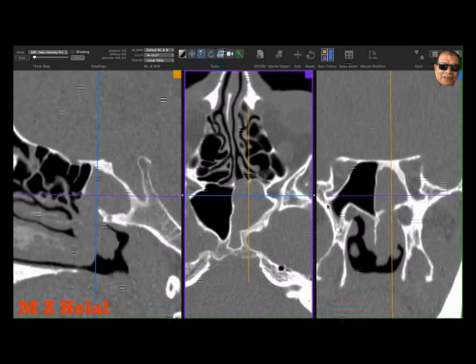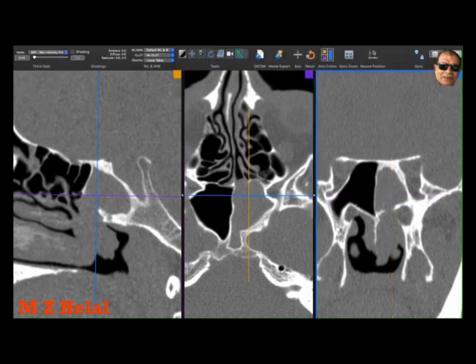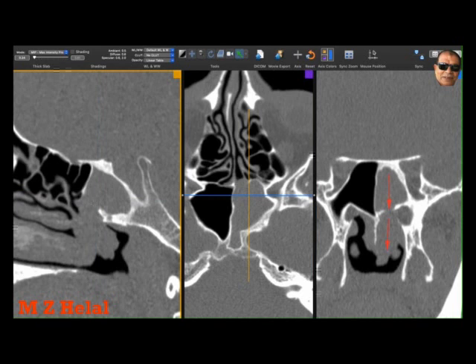Bismillah ar-Rahman ar-Rahim. I'm going to present to you this male patient, middle-aged, with left sphenoiditis and a left sphenochoanal polyp. Here is the opacified sphenoid and the polyp coming down from the left sphenoid — this is the widened sphenoid ostium.